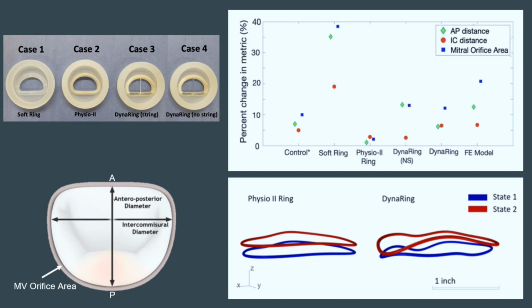Finer ring discretization with an increased number of segments may further improve results. Segment stiffness selection is an attractive feature of this product and enables the designer to match patient-specific requirements.